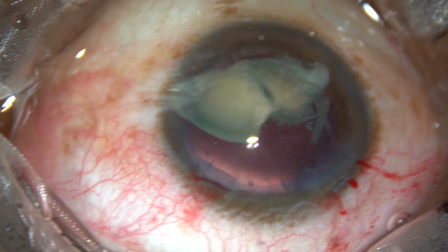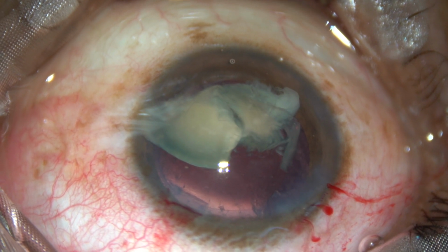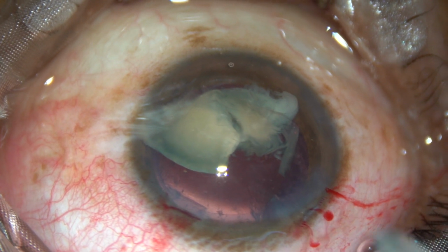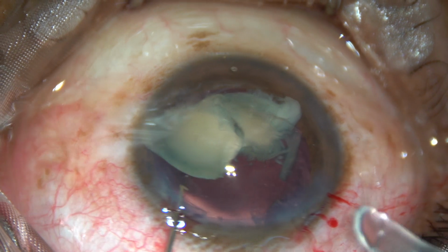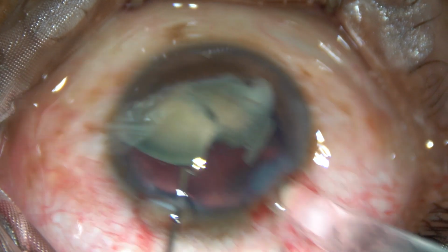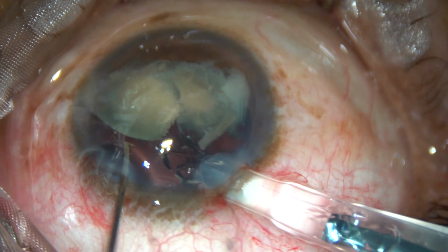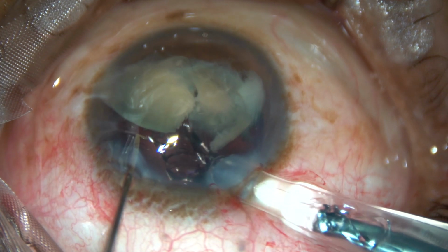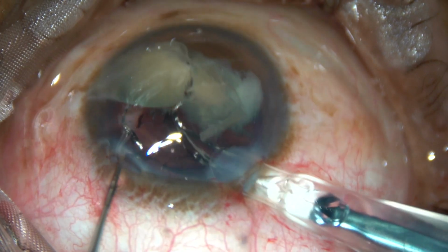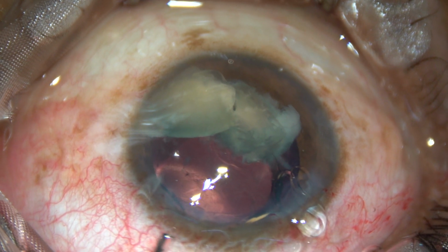And now I ask for the lens. In this case I was quite sure that I will be able to place the lens in the capsular bag. So the lens which was selected for this case, a hydrophilic acrylic intraocular lens, is being placed in the capsular bag.